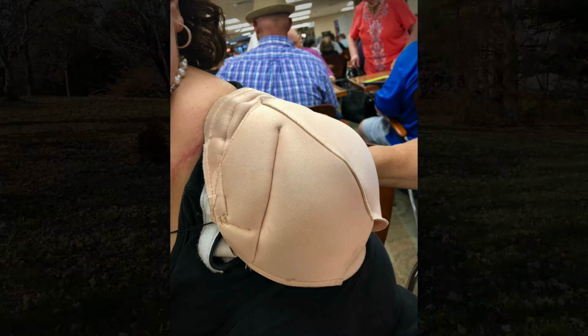She also has a friend who's a seamstress, and they rigged up this that you see here together. She showed it to me graciously in the cafeteria of MD Anderson, and that was where I first started getting the idea of making a homemade shoulder prosthesis. Hers is a little different than mine in that it is not attached to her bra, but it works very well for her.